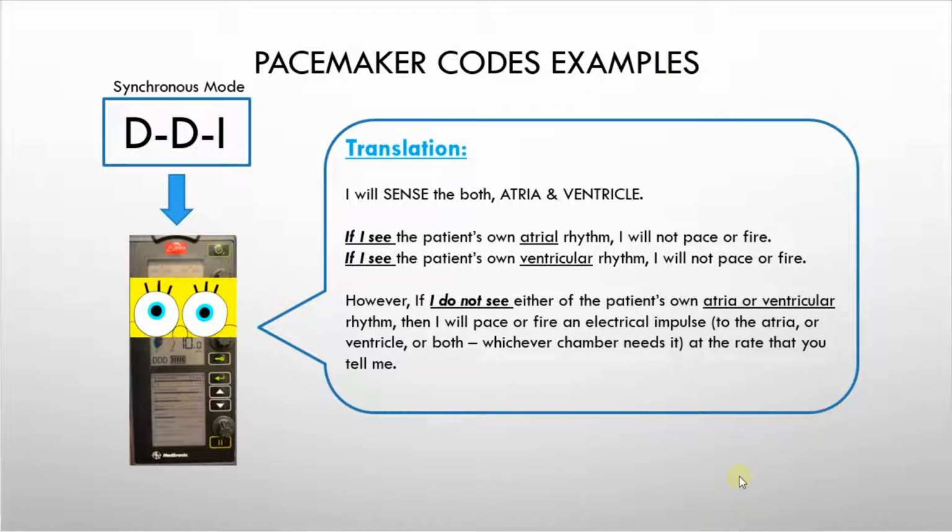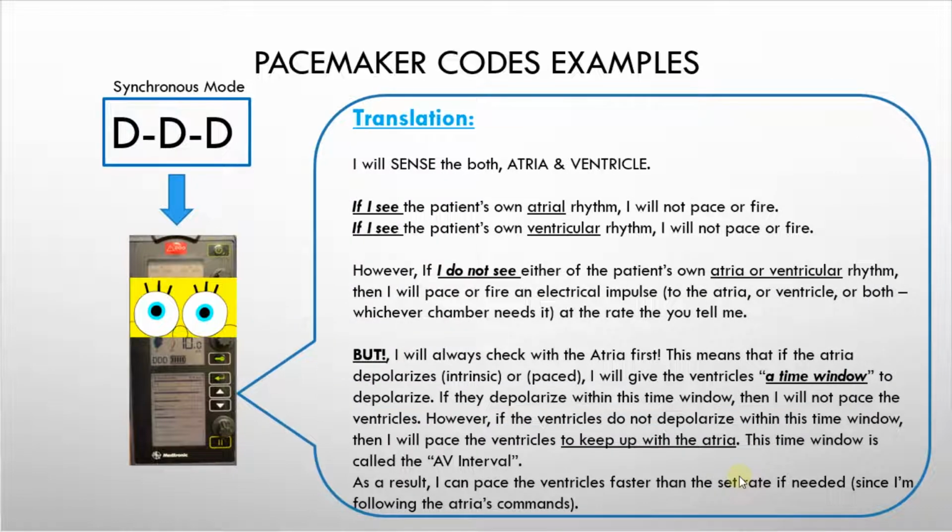It just mixes AAI and VVI together. Which brings us to an even more common mode that we use, which is triple D. Now, triple D is slightly similar to DDI with one key exception.